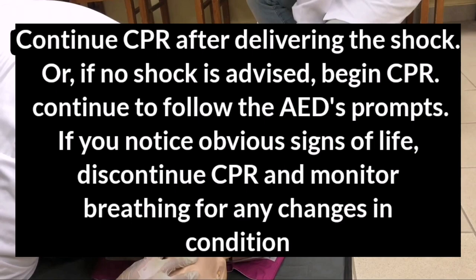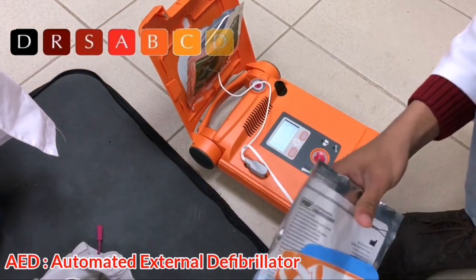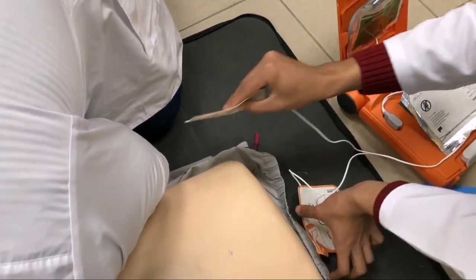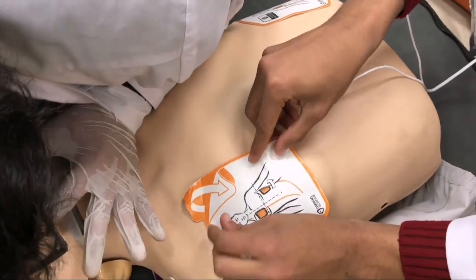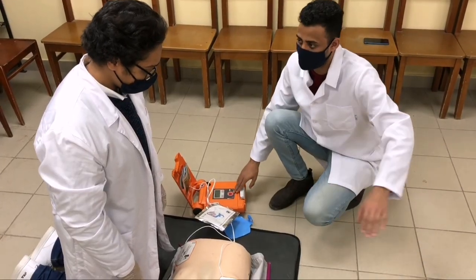If you notice that there are obvious signs of life, discontinue CPR and monitor breathing for any changes in condition. Attach an AED if one is available and follow its voice prompts. Keep doing CPR while the AED is being attached. Stay clear.